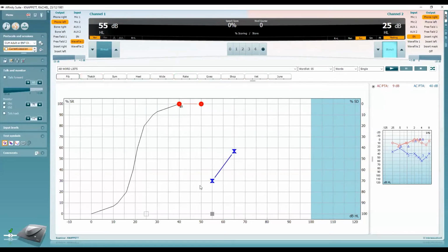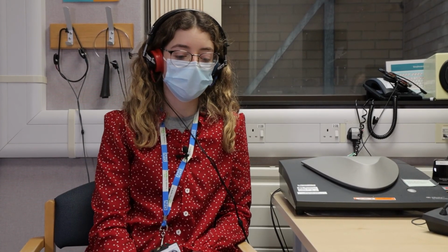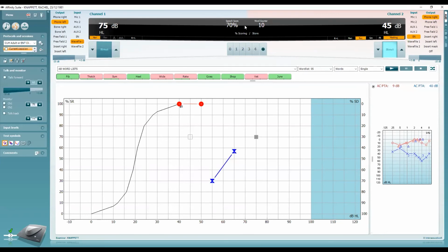So now I've got 2 points. I can see that the scores are increasing. So I'm happy now to go up from where I started. So we'll go up to 75. And we'll run another list. Feb. Can't really hear. June. Okay, so this time my patient has scored 70%. I'm going to store that.